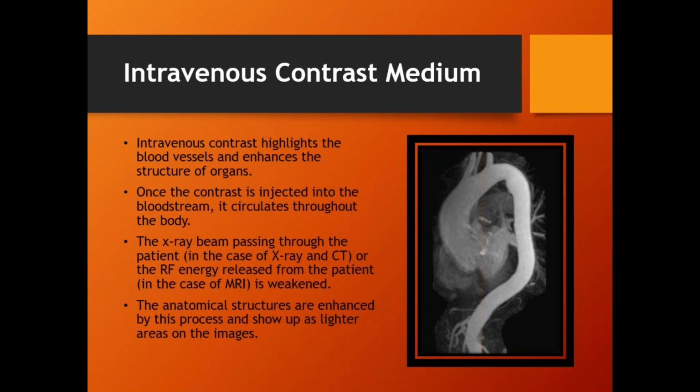If I want to look at this chamber of the heart, I fill this chamber of the heart with contrast. This is a living patient. That contrast will be there literally 1 second, because as soon as the heart beats, it moves. Heart beats again, it moves again. So they're literally chasing this contrast through the patient's system.